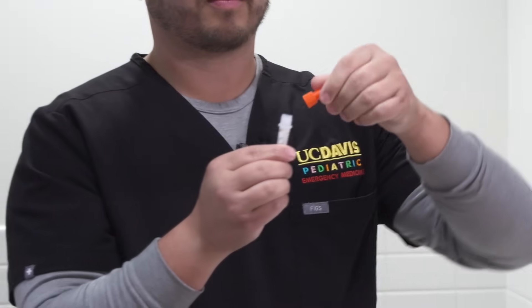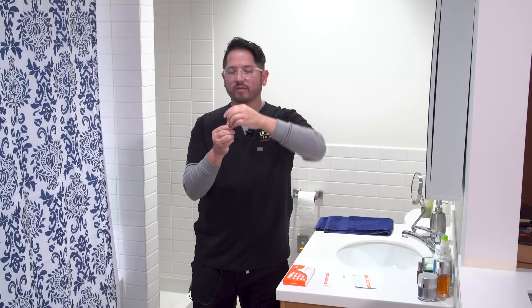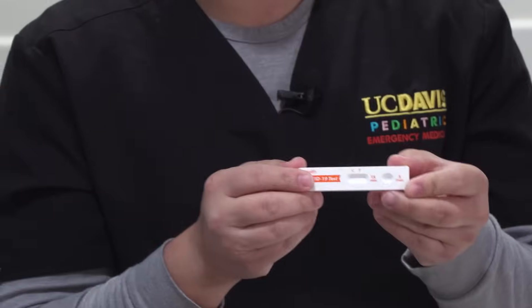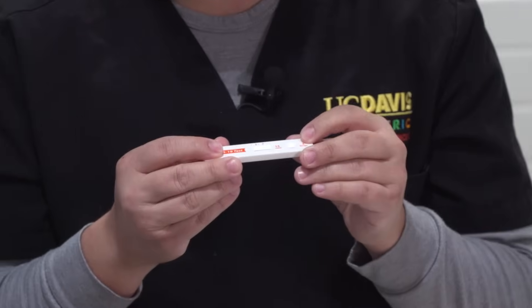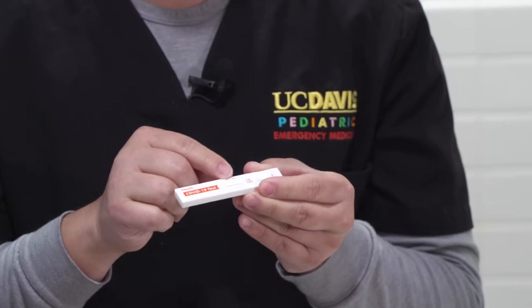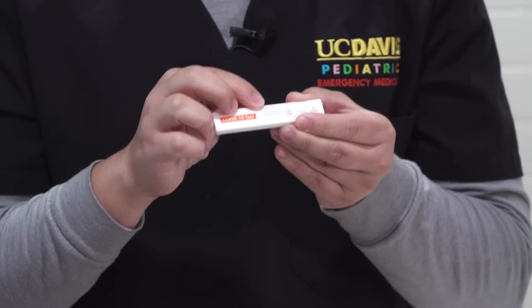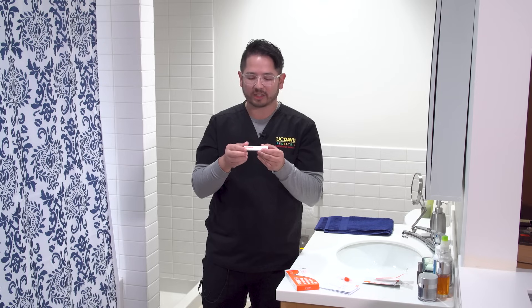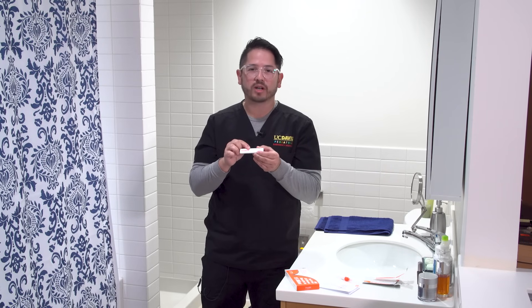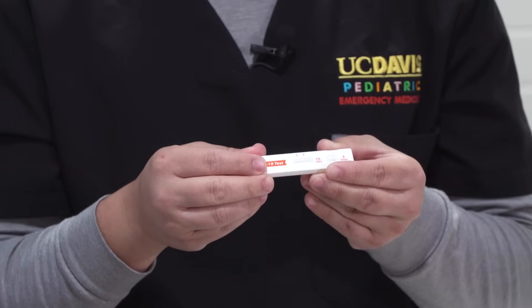Go ahead and grab your cap and replace it. You can set this aside for right now. The test kit itself has a collection sample portion which requires three drops of the liquid as well as the test results. You'll see a C and a T. It's imperative that you get a line at the C which is the control, which lets you know that the test is working. If you don't get a C within the three drops within the 15 minutes, your test sample is no longer valid and you have to use another test.